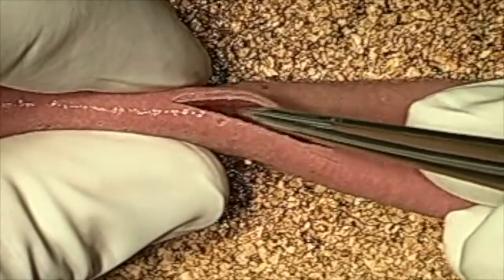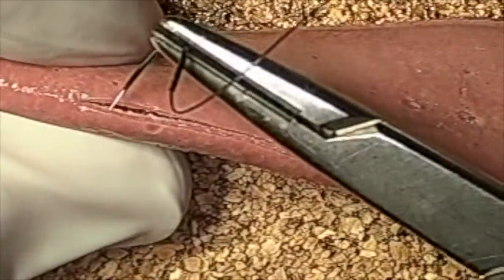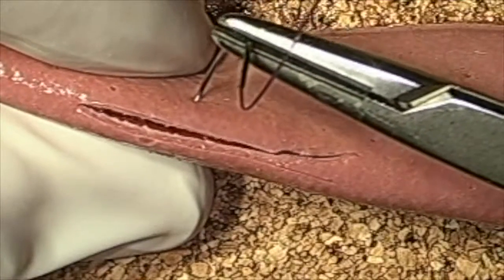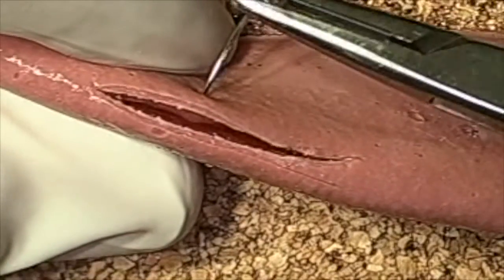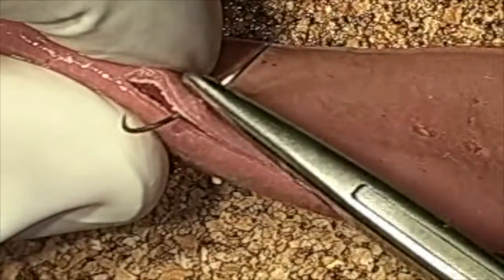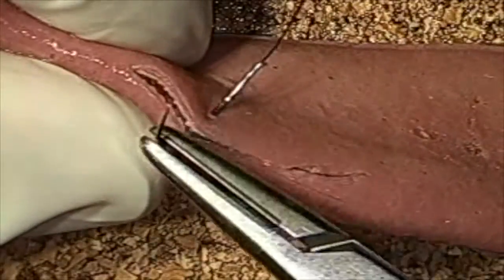Here you can identify that white line, which is going to resemble our submucosa. So when you take your bite, we're going to focus on doing a modified Gamby for now. This also can be done in full thickness. I typically take my bites in the middle and then try to half each segment. The modified Gamby allows us to put that tapered needle right underneath the submucosa.